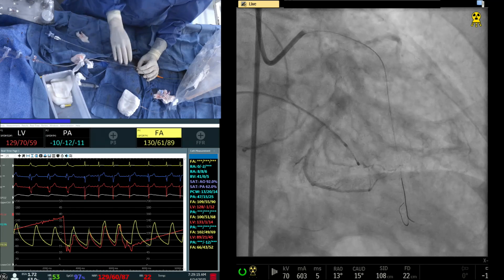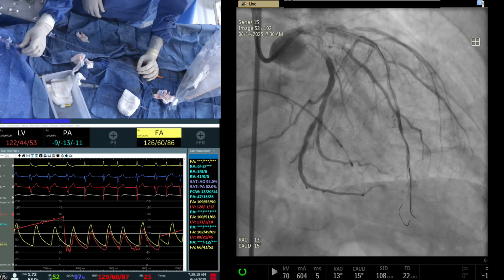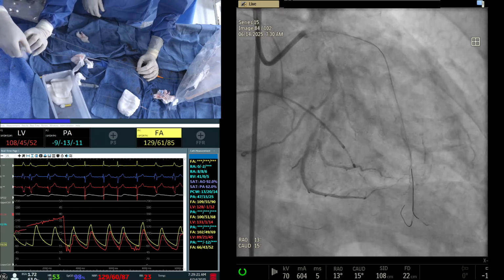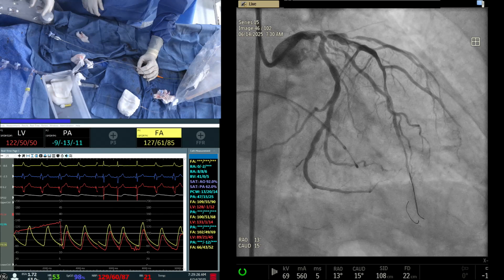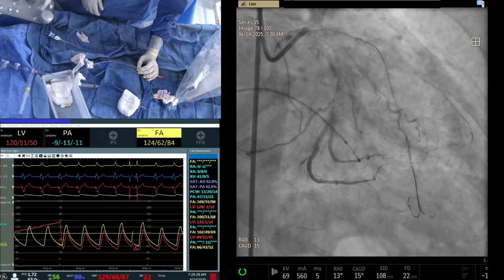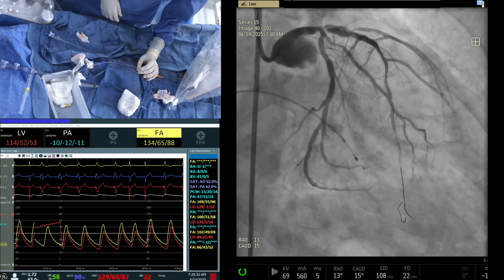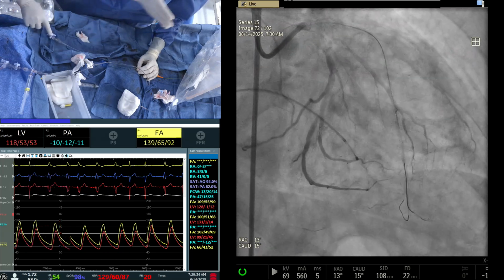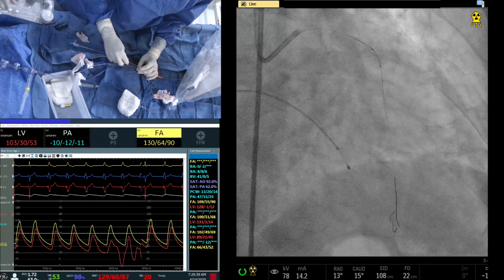See there? You want to put a long one, or just after the diagonal, let's put a 2.5? Is there bad dissection in the ostial proximal LAD? No, it's the same tight lesion. We are not ballooned at all yet. You want to put just short? Or we take care of the balloon. 2.5 by 28, right? Yes. Okay, come here.